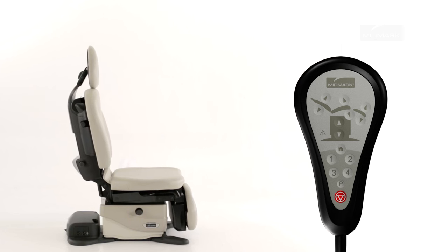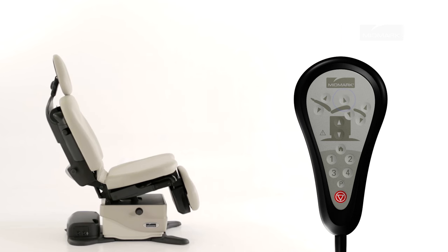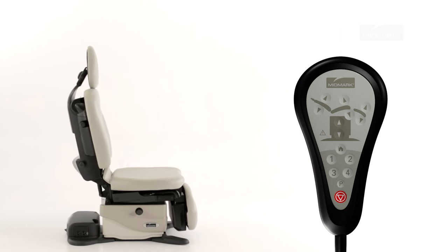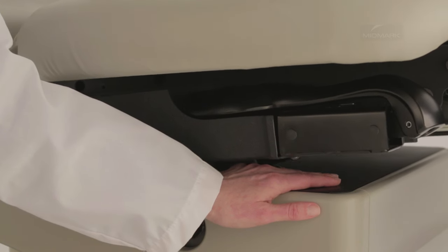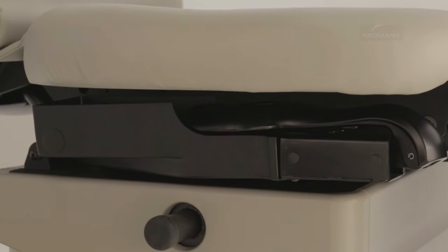To tilt the seat section up or down, press and hold the appropriate button. Movement stops when the up or down button is released, the maximum or minimum position is reached, the active sensing technology is activated, or the stop button is pressed. The active sensing technology will disable the tilt down function if the underside of the seat section or the foot section contacts an object other than the table. You will hear a single beep if the active sensing technology is activated. To resume the tilt down operation, remove the object from the underside of the seat or foot section, check if the foot extension is extended, then press the tilt down button.